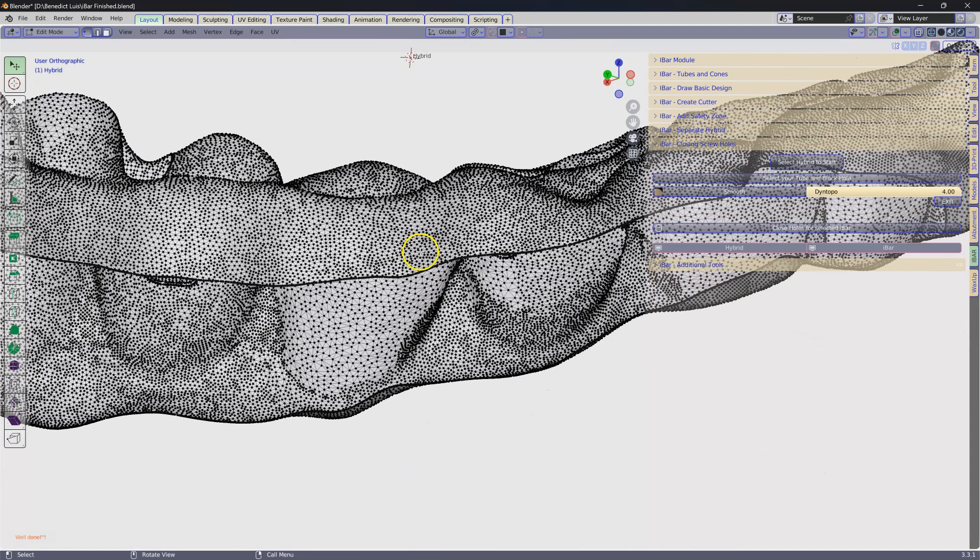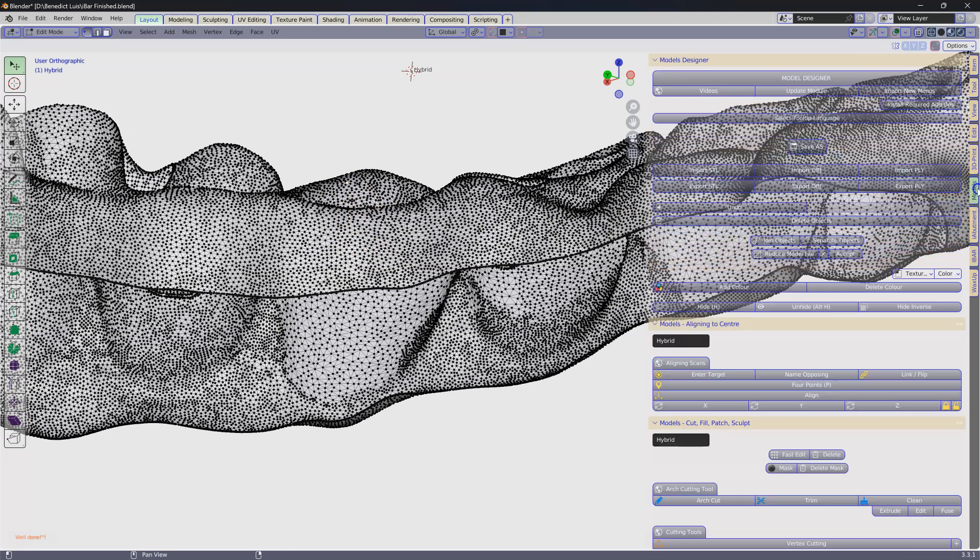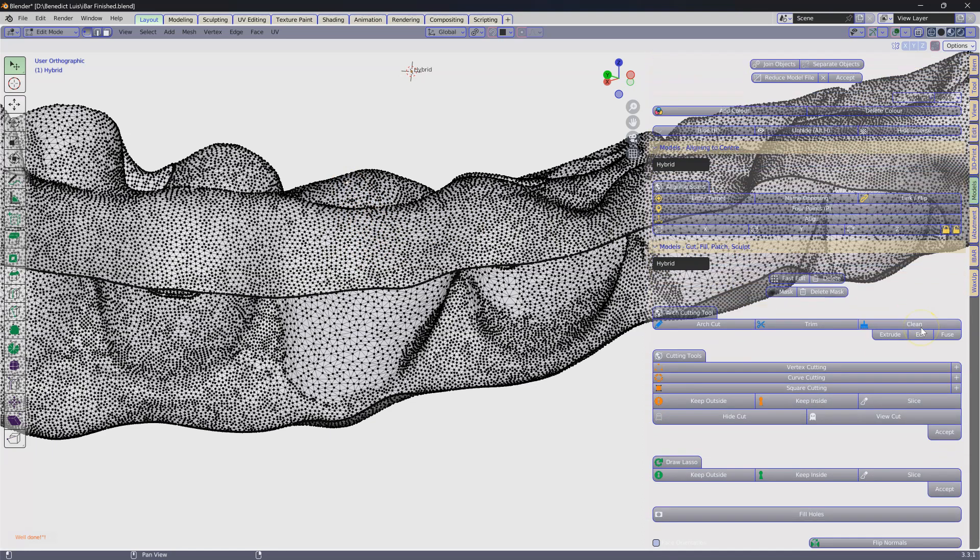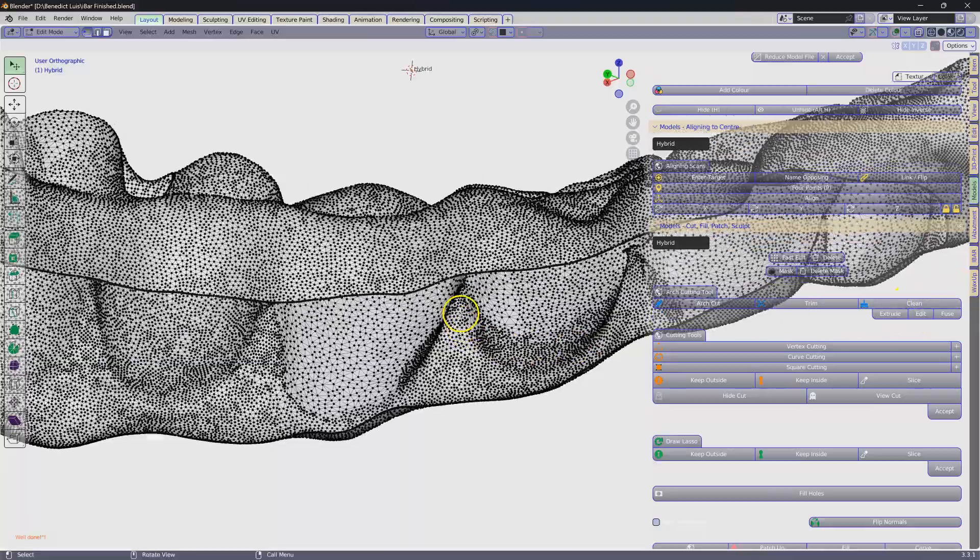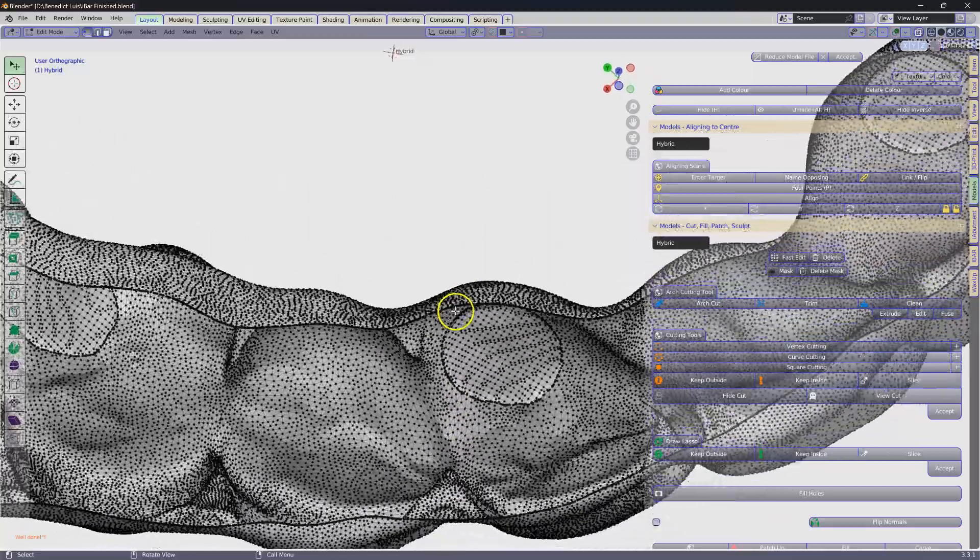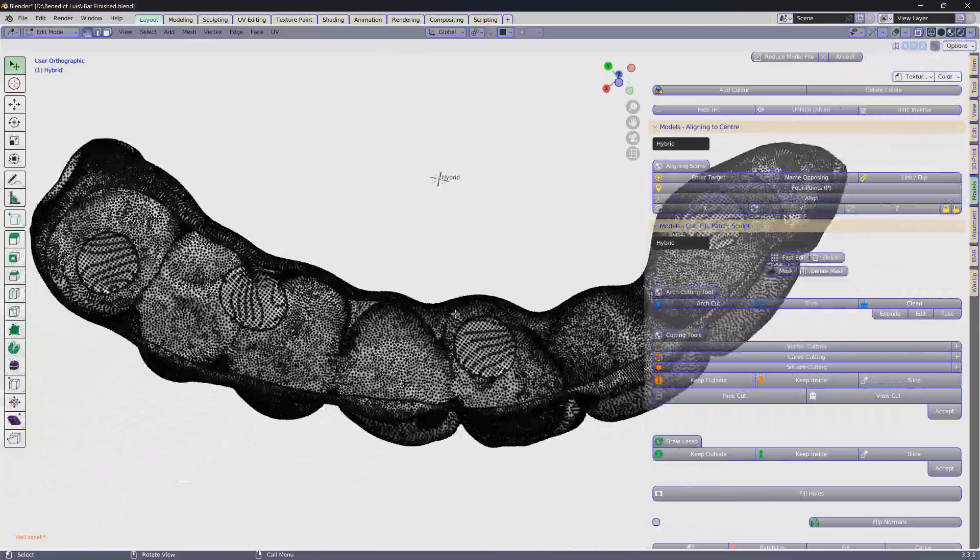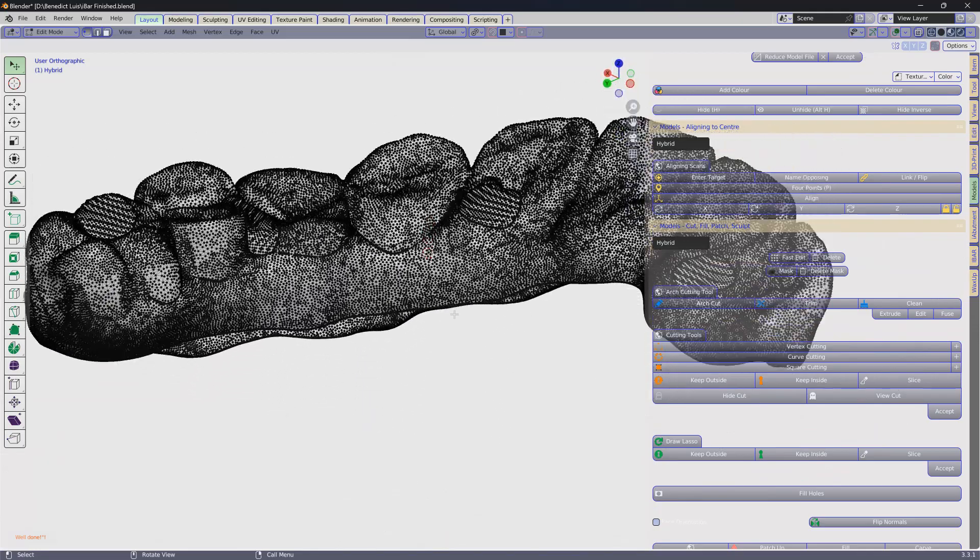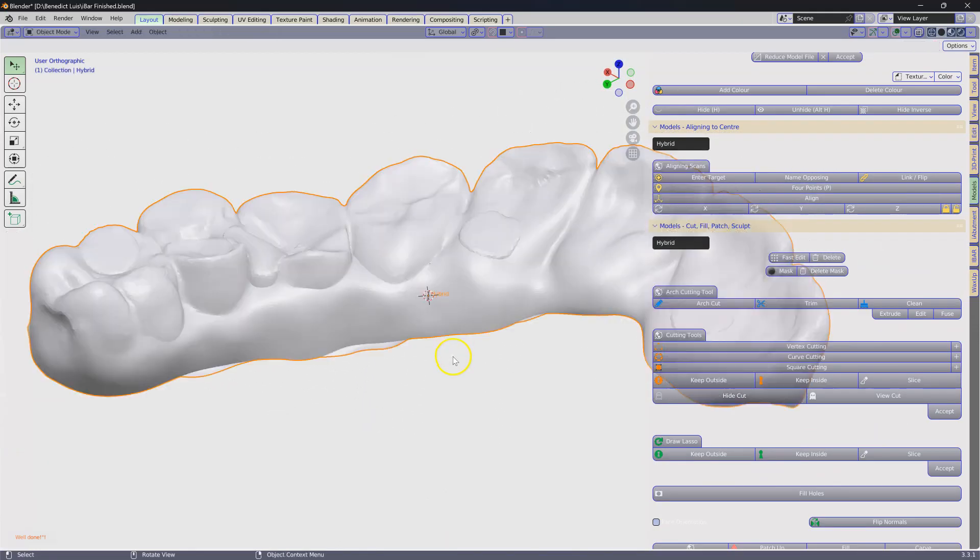The next thing we're going to do is select a vertex anywhere on the outside. Go to the model designer and you're going to find yourself the clean button that's going to delete the inverse of it. Now this is your eggshell. Tab to get out of it.